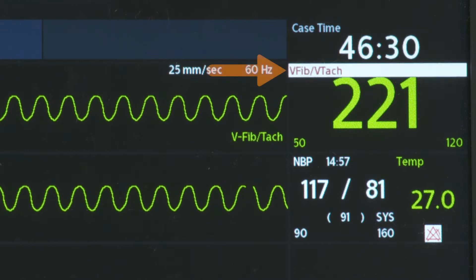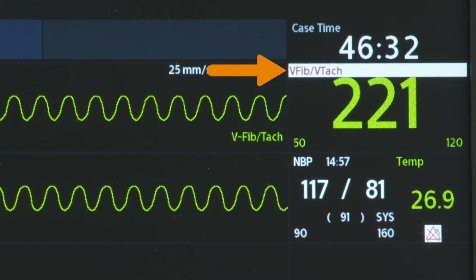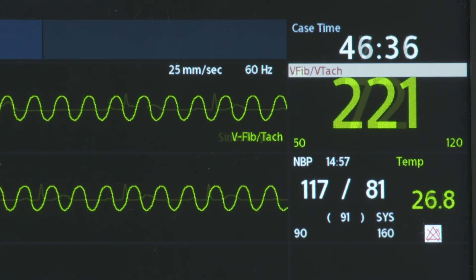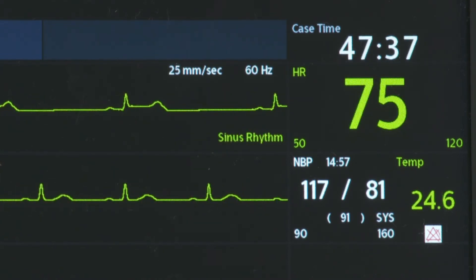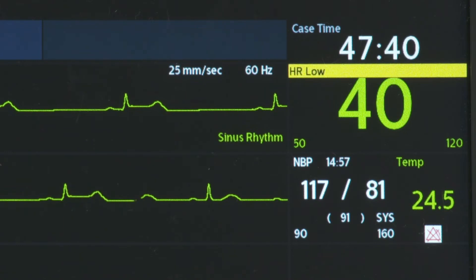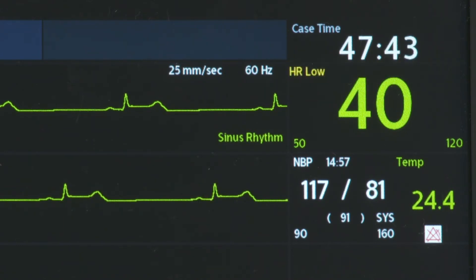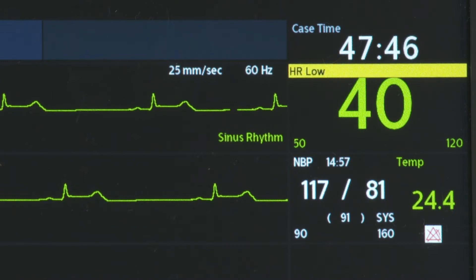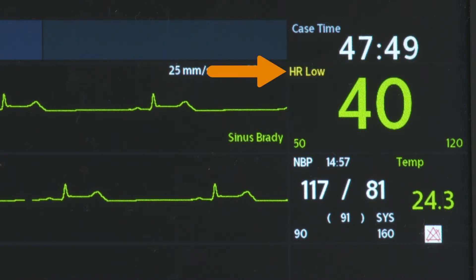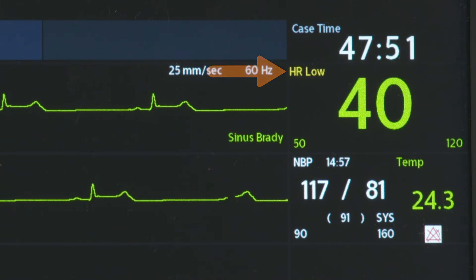The high priority alarm message displays with a red background. A medium priority alarm indicates a non-life-threatening condition, such as when the heart rate measurement violates the high or low limits, and requires a prompt response. The alarm message displays with a yellow background.